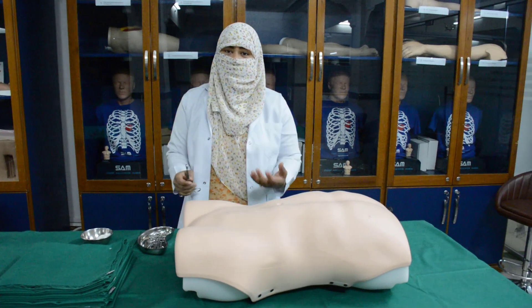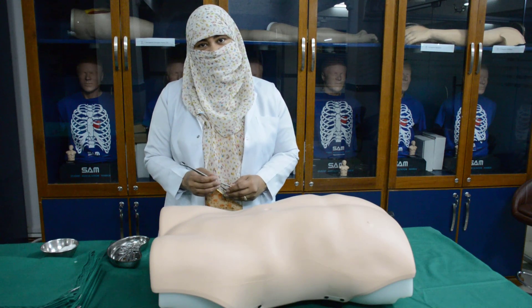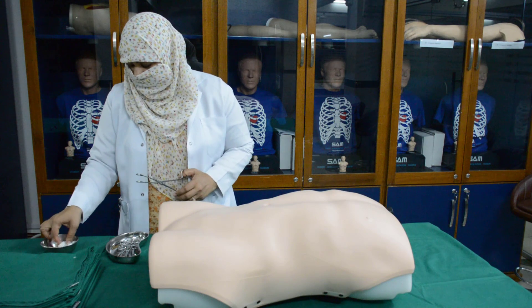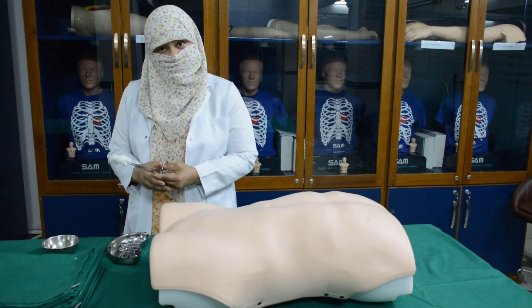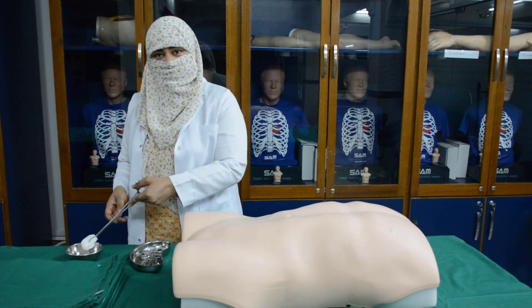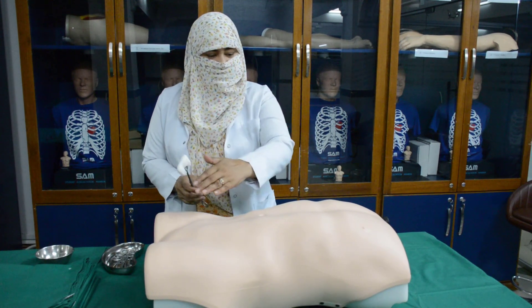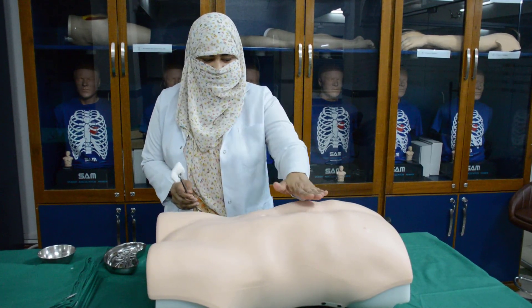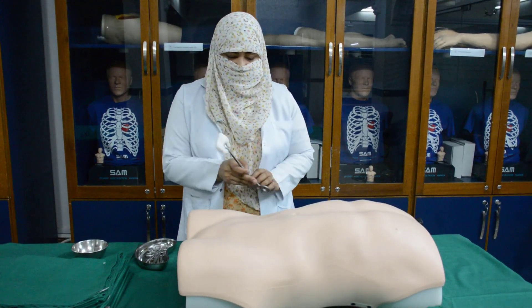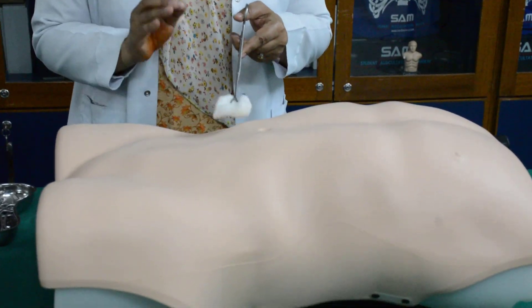For the purpose of teaching, we will learn how to clean the patient for the open appendectomy procedure. We will take the gauze, dip it into the Povidone solution, and then begin. You can see here this is the dummy of the abdomen, in which the abdomen is clearly visible along with part of the thorax and part of the thigh. We will start from where we need to begin the procedure of appendectomy.